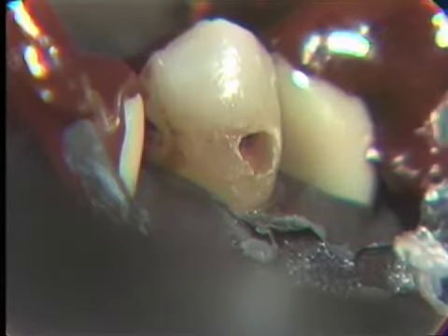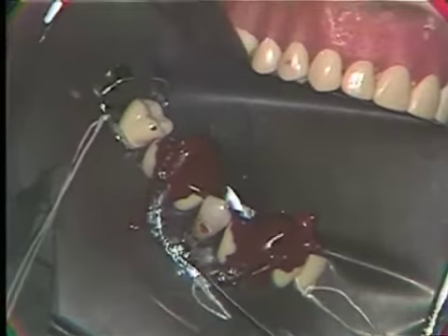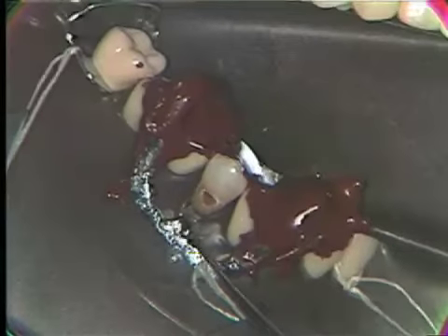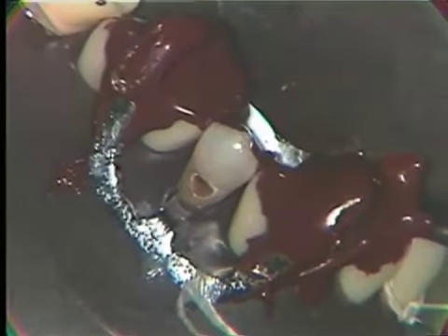You'll also note that the rubber dam has been placed and that a 212 cervical clamp has been put in position, supported by compound. This is to give a retraction of the tissue, to expose the carious area, and to give a better working site for us to restore this particular cervical area. Now, the method that we use in the preparation of this is not different than the Class 1, except that it is on the buccal surface.